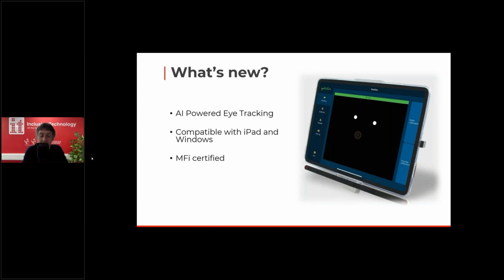In addition to that, Eyetuitive also has a built-in chip for accelerated processing of neural networks, the so-called NPU. In addition to the AI-powered eye tracking, the second point there is that Eyetuitive is compatible with not only iPad but Windows as well.